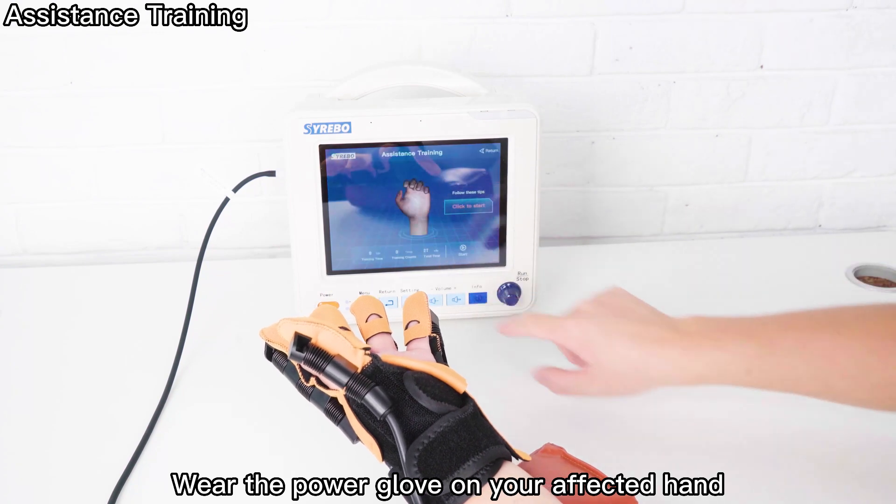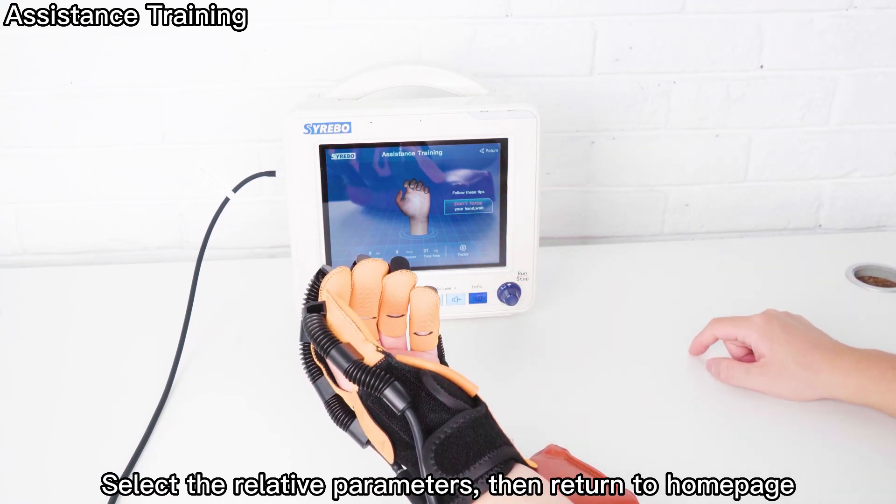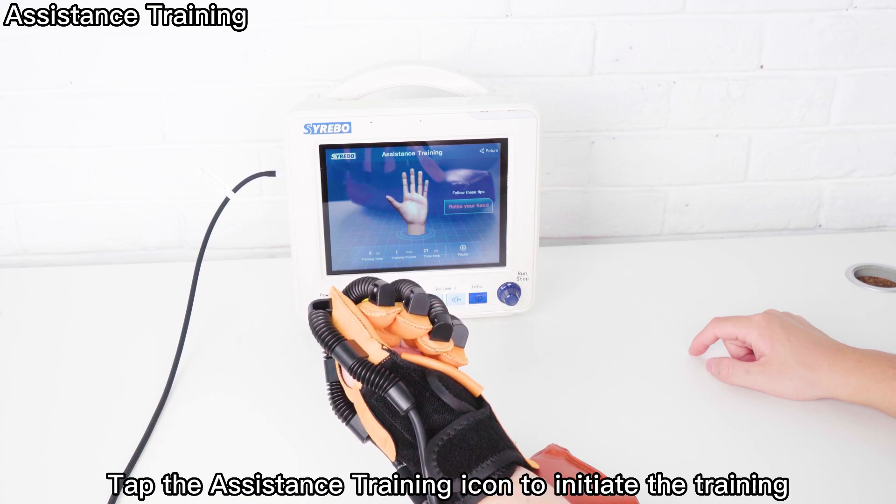Wear the Power Glove on your affected hand. Select the relative parameters, then return to the home page. Tap the assistance training icon to initiate the training.